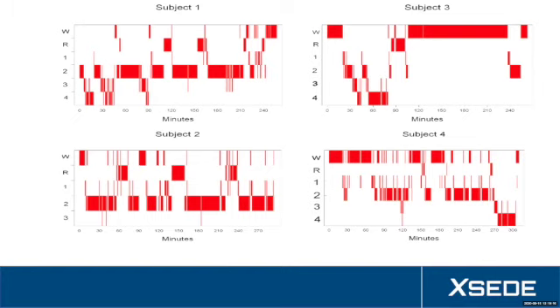But subject 1 has a near ideal hypnogram where stage 4 sleep shows up almost immediately as the subject went to sleep. Sleeping in the MEG instrument is not easy, and that's probably why subject 2 on the bottom left showed almost no stage 3 or 4.